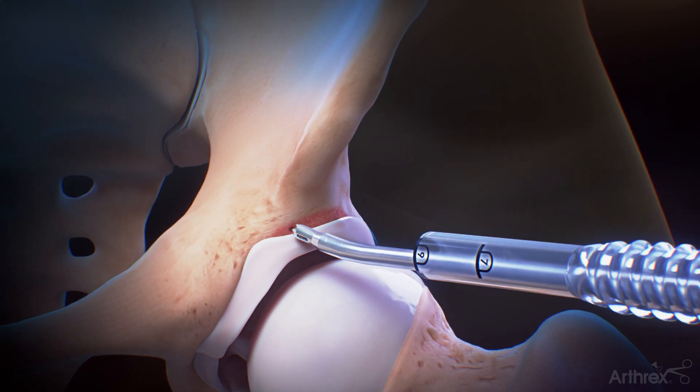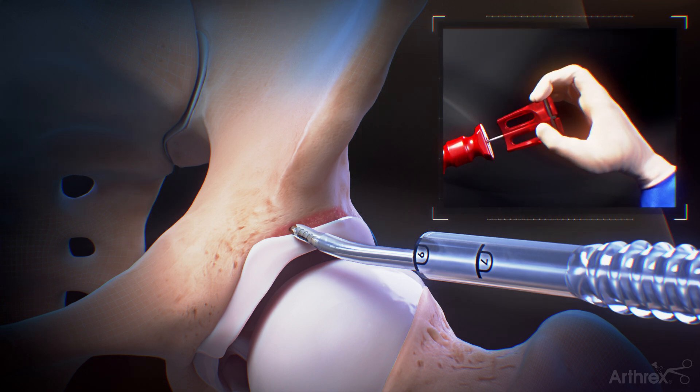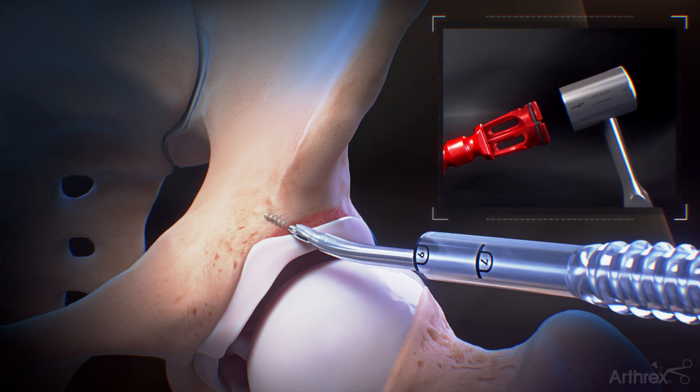Insert a 2.4 mm knotless hip suture tack through the drill guide. Push the anchor in by hand to engage the tip of the anchor in the socket. Impact the anchor until the positive stop on the back of the drill guide.